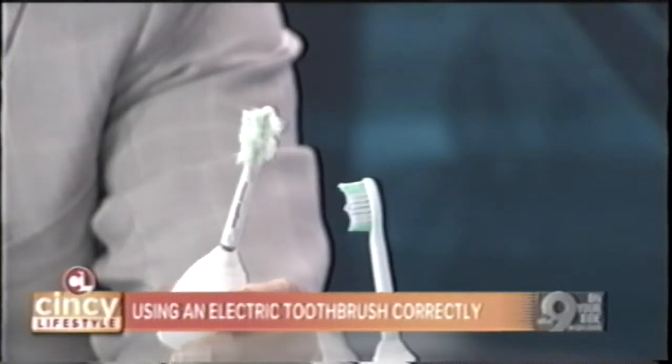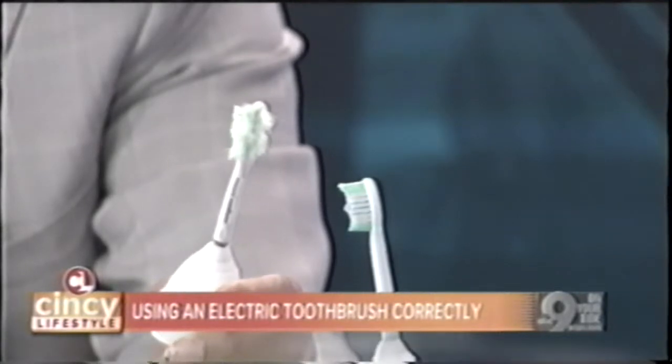All you have to do with an electric toothbrush is put it on one tooth at a time and let it work — count to five seconds, then move on to the next tooth, and the next, and the next. What's nice about these brushes is that they have timers on them so you know where you are. But if you push it, it's not going to work, just like a saw can't cut easily when forced.